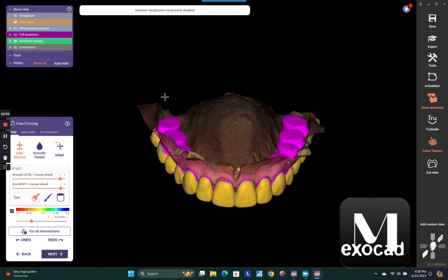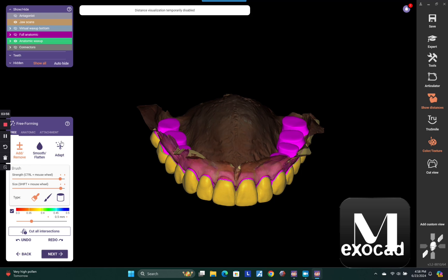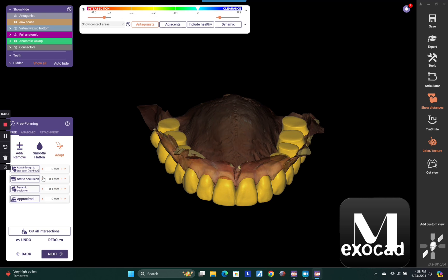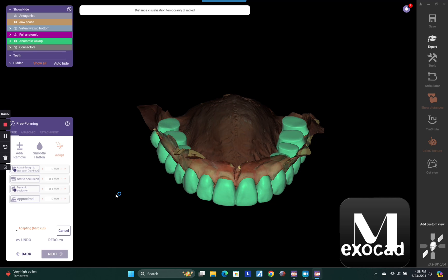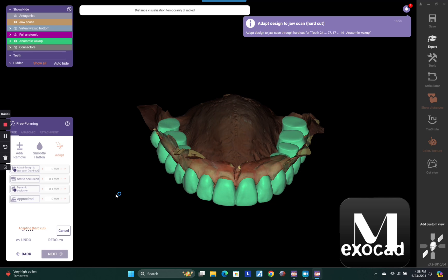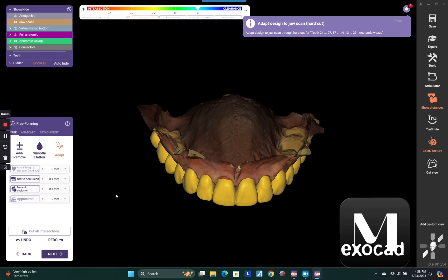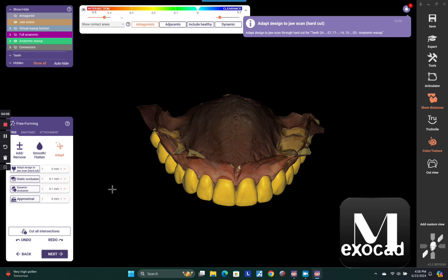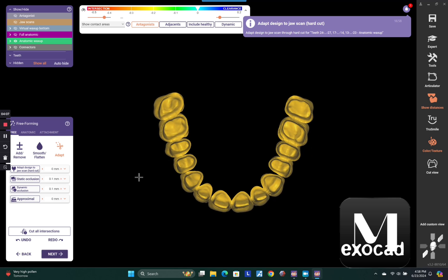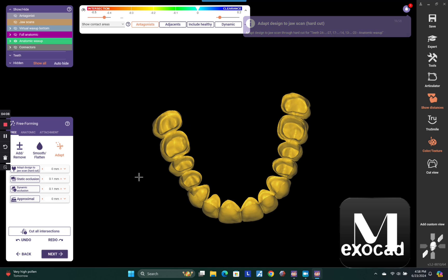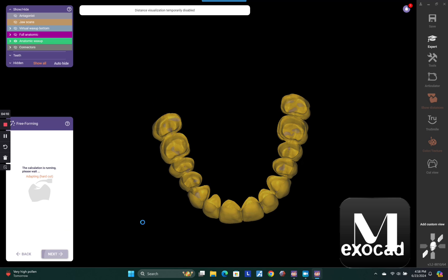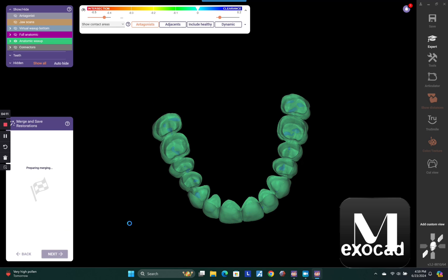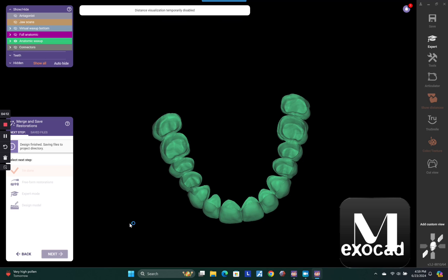Now, lastly, and probably most importantly, you need to go ahead and adapt and then do adapt hard cut to jaw scan. And what that does is it takes that original wax up that you did and slices it to fit your preps. And really what it's fitting is the blockout model that ExoCAD created. And that's it.